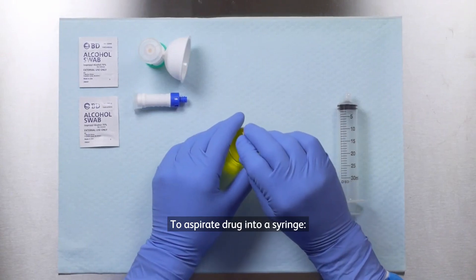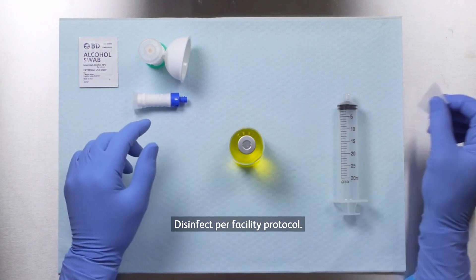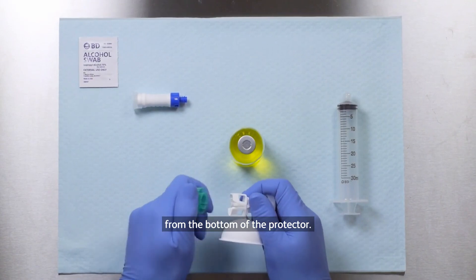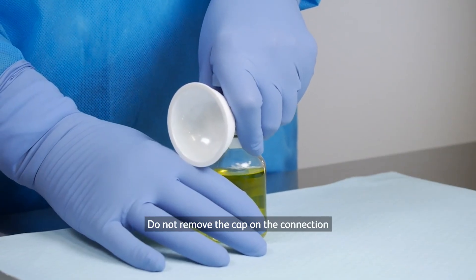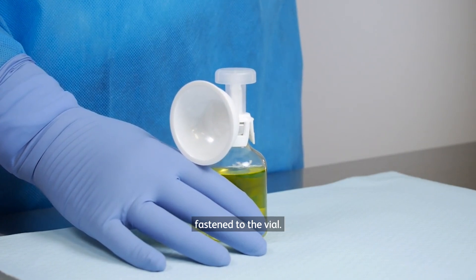To aspirate drug into a syringe. Disinfect per facility protocol. Remove the protection cap from the bottom of the protector. Attach the protector until it snaps on the vial. Do not remove the cap on the connection interface until the protector is securely fastened to the vial.